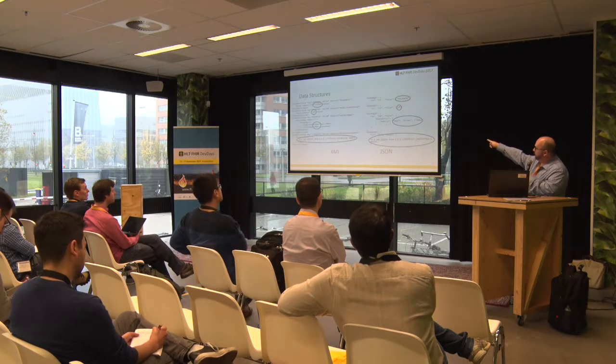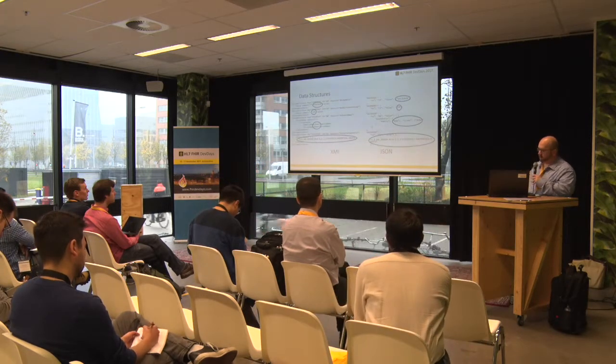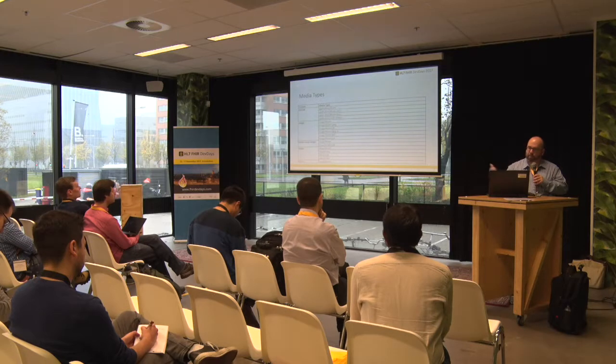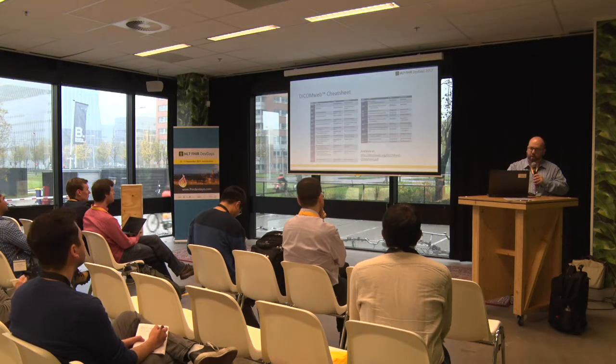There I see the study date, the modality, that's a CT study for John Doe, and there's the study instance UID that I can grab there. And as I mentioned, you can grab all the different kinds of data types. It not only supports images, but also video and audio and waveforms and things like this. You can also grab the raw DICOM if you want.